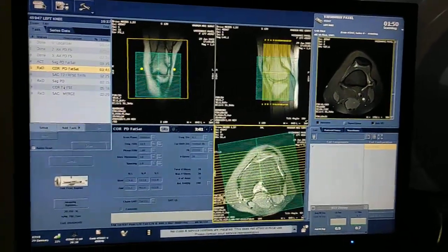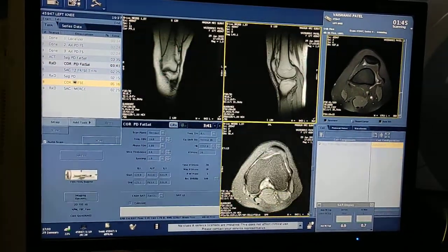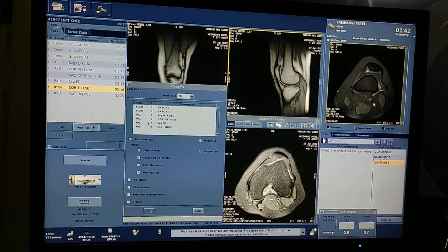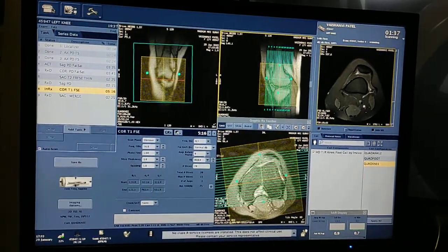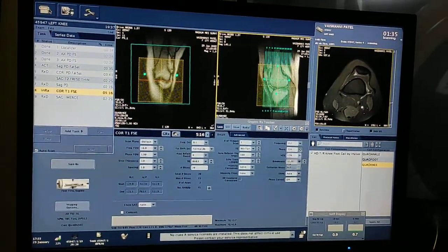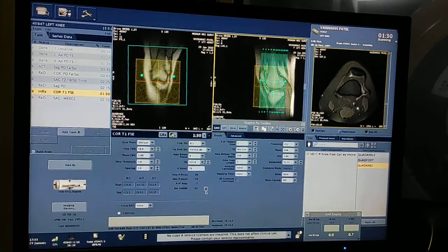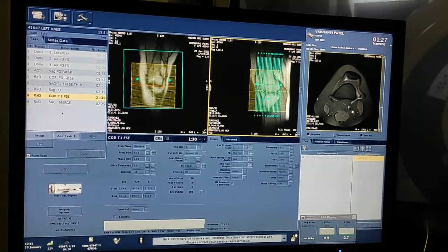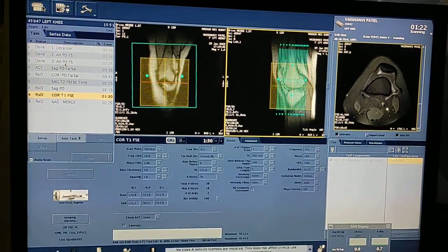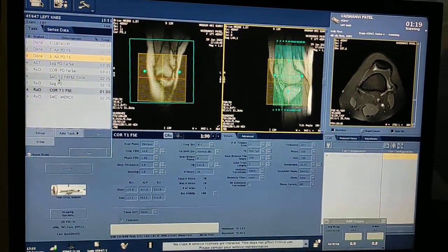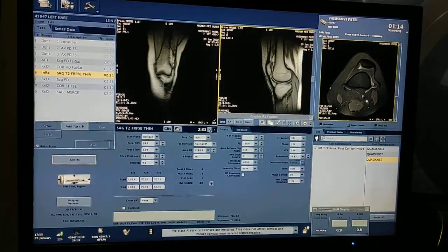Now I am planning coronal T1. Simply double click on the sequence, select the RX window, and copy from the fat sat PD selection — the same sequence has been copied. As I said, if you want coronal you can copy from coronal, axial from axial, sagittal from sagittal. My scan is ready: axial ready, sagittal ready, coronal ready. Now I am planning sagittal T2 thin sections for ACL and PCL.